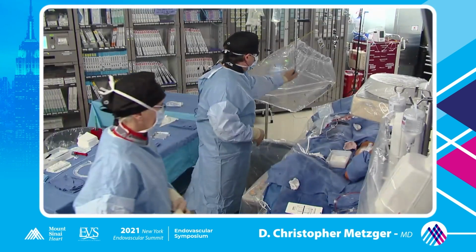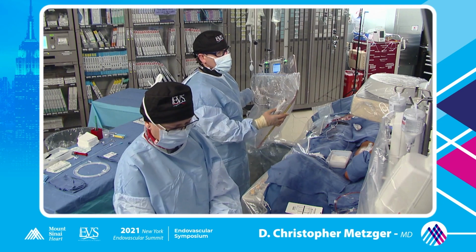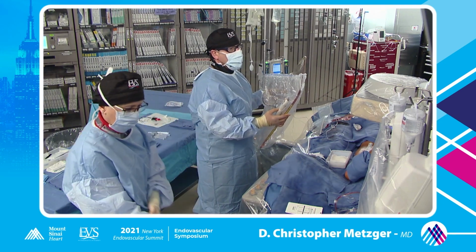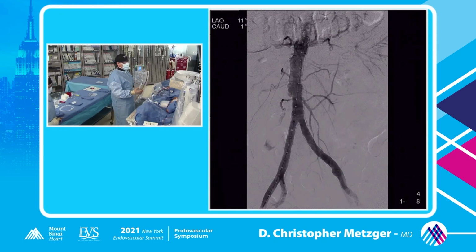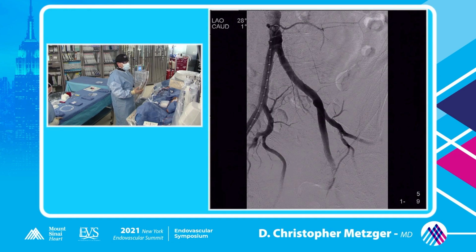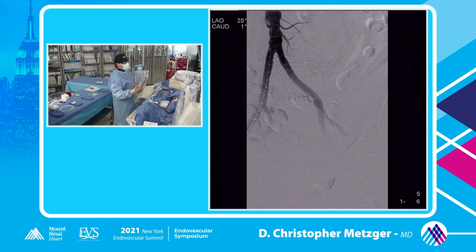So let me go back to our images, what we've done so far. So we do vascular ultrasound assisted access, and it actually looked a lot better, both ultrasound and angiographically. The aorta iliac is not too bad. A little ectatic. Good flow down the right leg, and then you see a similar scenario in the left common femoral artery. I think you can see that.